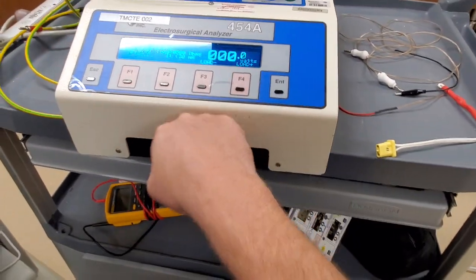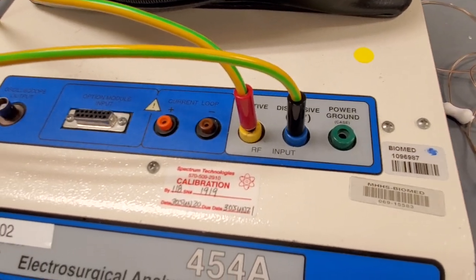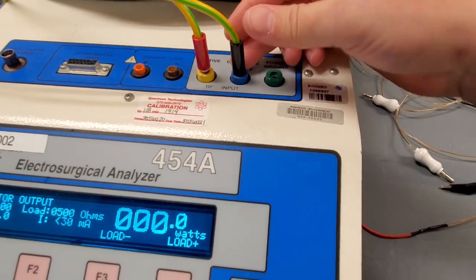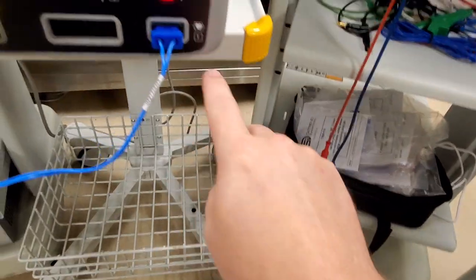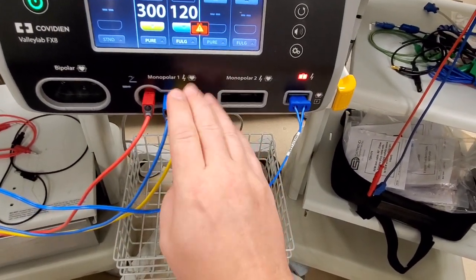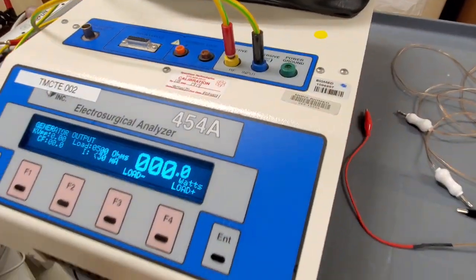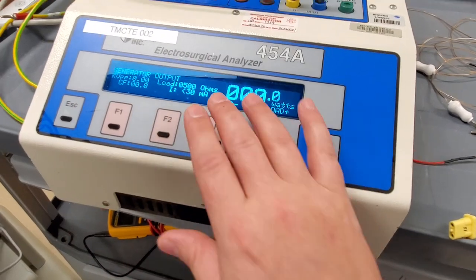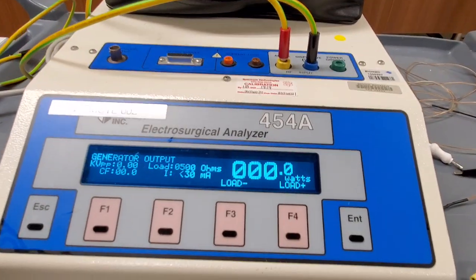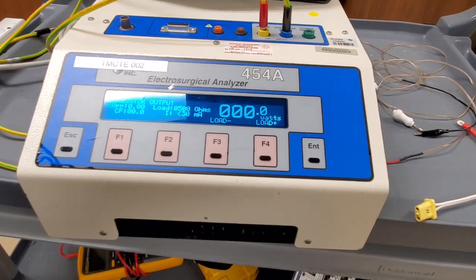The only thing I dislike is I wish it had a handle on the top. The ports are active, dispersive, and power ground. Almost all your measurements are done with two banana plugs. I've got two wires that I made up - this one here is going to be to your REM port and your active is going to go to your pen usually. It was really just two connections, and all these other things are just features you don't necessarily need.